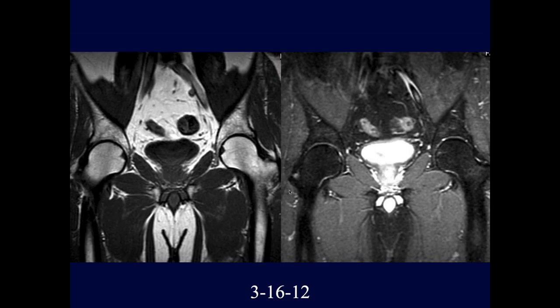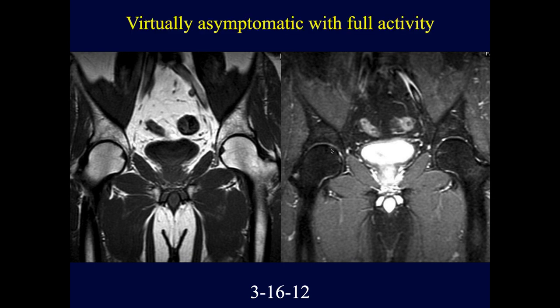And this is what it looked like now in March of 2012. I think even though there is a little bit of irregularity of the subchondral bone, the edema has resolved. I think that's just the fovea area. No, wait, sorry, it's not the fovea. The fovea is more... Yeah. And at this time, he is back doing full sports activities and was completely asymptomatic.